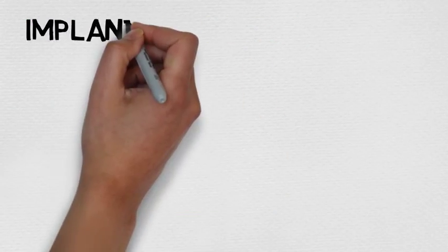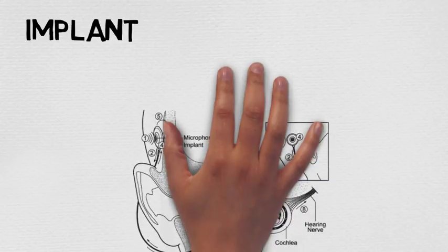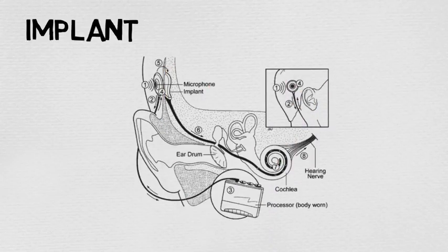Block diagram for key components in a typical cochlear implant system. The implants contain another coil that receives the radio frequency signal and also hermetically seals electronic circuits. The circuits decode the signals, convert them into electric current and send them along wires threaded into the cochlea. The electrodes at the end of the wire stimulate the auditory nerve connected to the central nervous system, where the electrical impulses are interpreted as sound.